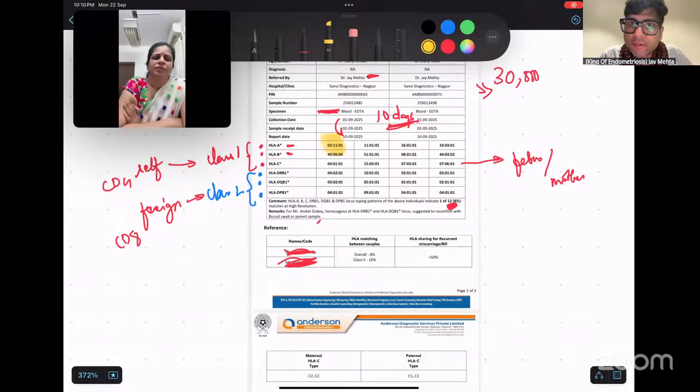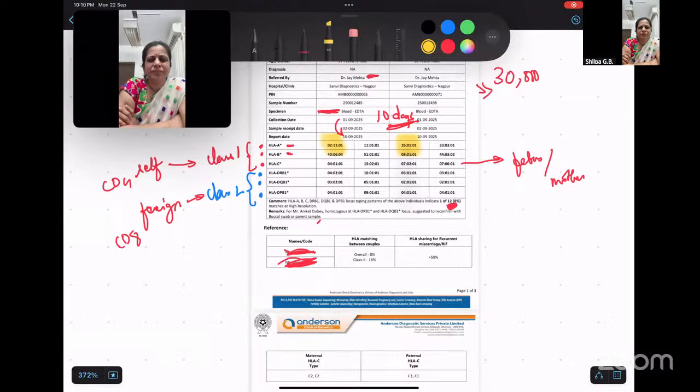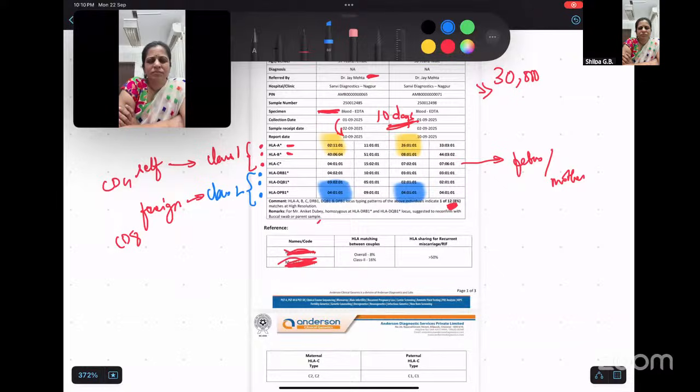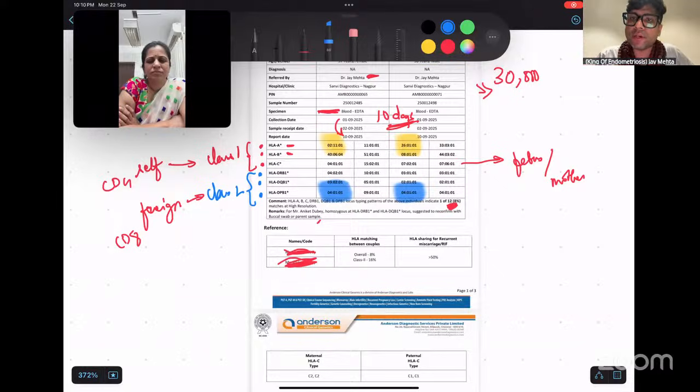Can you see this interpretation? 21101. Correct? Look at it in the female. It is not matching, no? 260101. Like that, if you see in the entire thing, only this matches. 40101, 40101. Correct? Rest everything is not matching with each other. If you just look at the report you study, you will understand. Look at this. This 100101 is not matching with 301, 1502 is not matching with 706, 401 is not matching with 702. Correct? Nothing is matching.